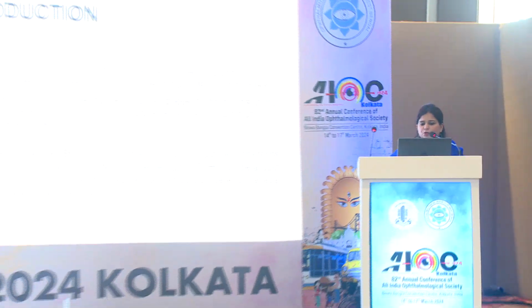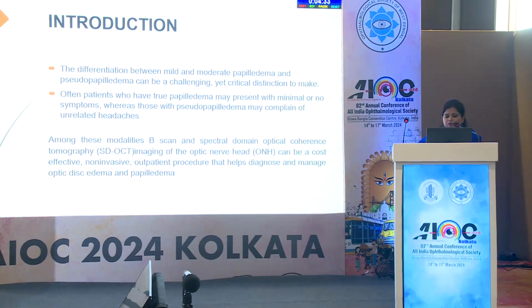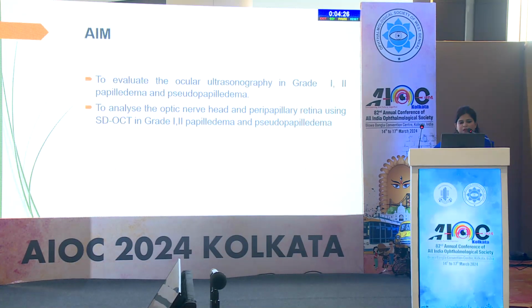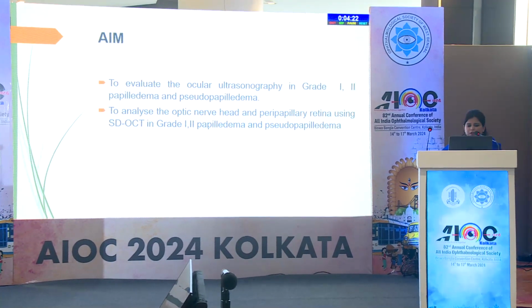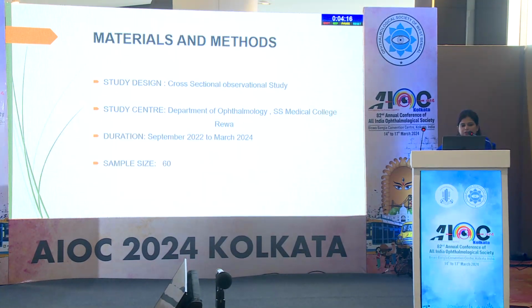Often, patients with true papilledema are confused with pseudopapilledema. Modalities such as B-scan and OCT can be a cost-effective, non-invasive outpatient procedure that helps in the diagnosis and management of patients with optic disc edema and papilledema. The aim is to evaluate the role of ultrasonography, especially in grade 1 and grade 2 papilledema, and also analyze the optic nerve head and peripapillary retina using SD OCT.